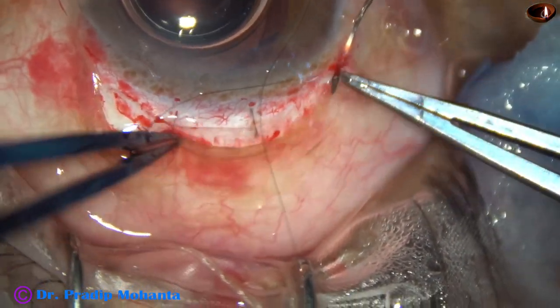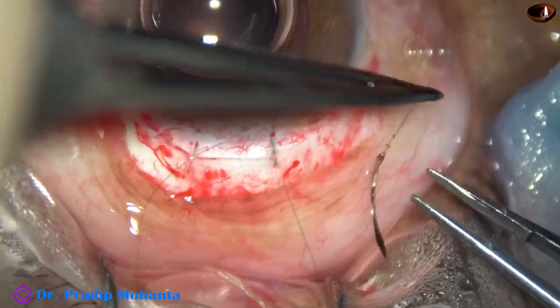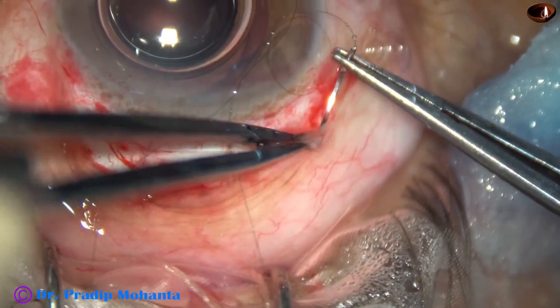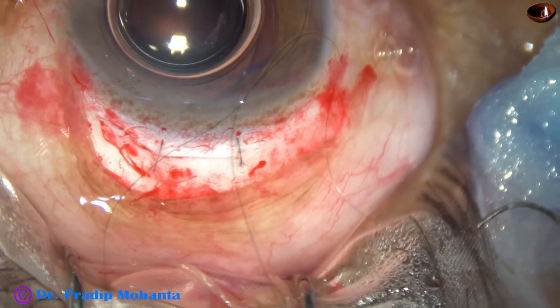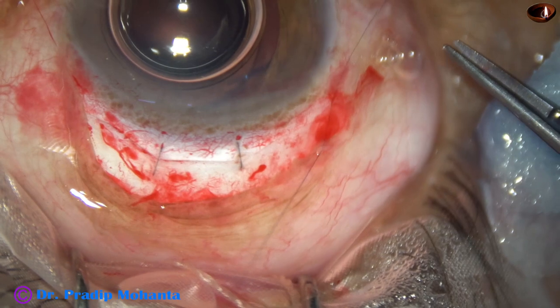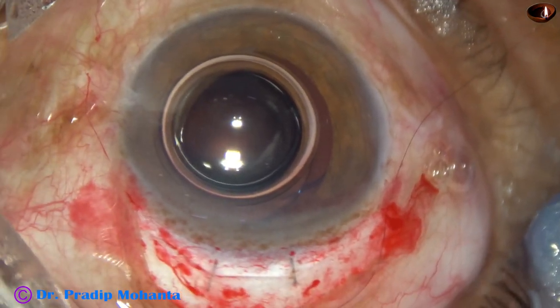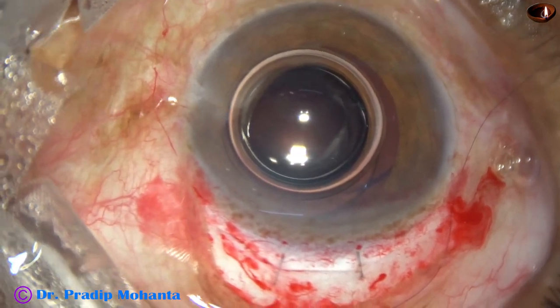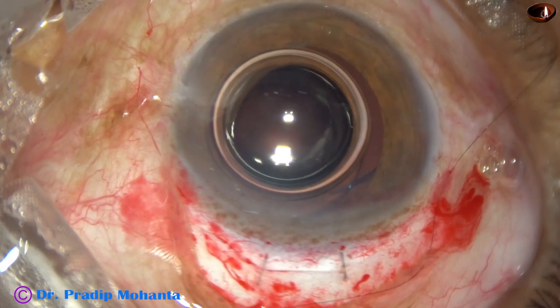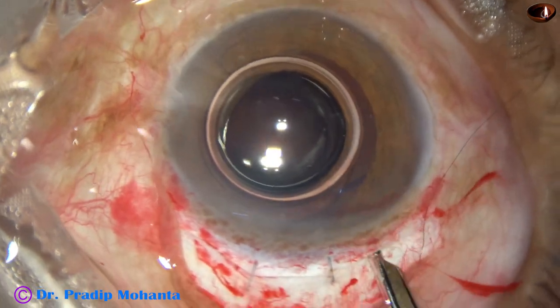And now this is another suture to oppose the conjunctiva to the limbus. And this is going to be a releasable suture. In releasable suture, there are three loops and then just pull the, just see this. Okay, we'll tie this suture later on. We have to remove the visco before that.